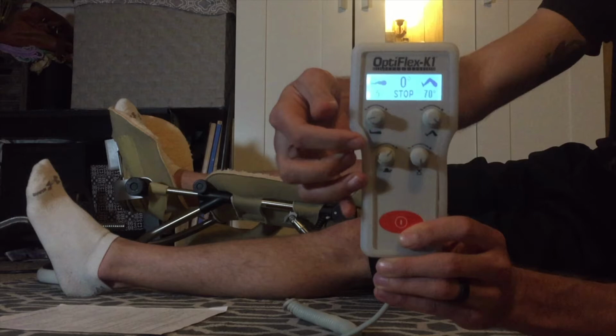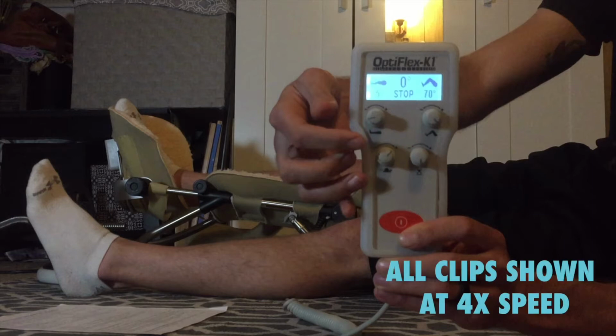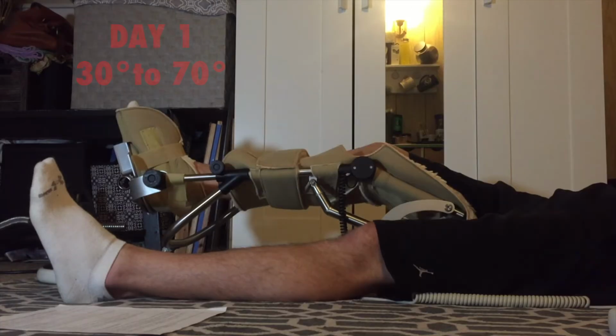Now I'll take you through the protocol that I followed. I started the day following my surgery and went from 30 degrees to 70 degrees.